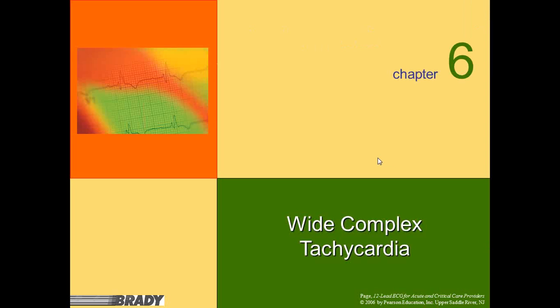Okay. Well, we've got your attention. I'm going to go ahead and go through Chapter 6 real quick, the wide complex tachycardia. And I know this seems a little bit complicated, but they're just kind of trying to give you all of the criteria for VTach.